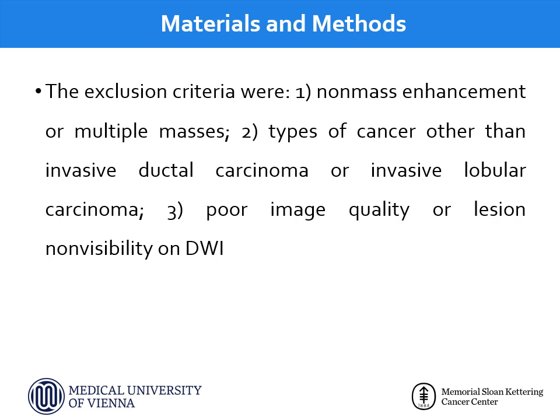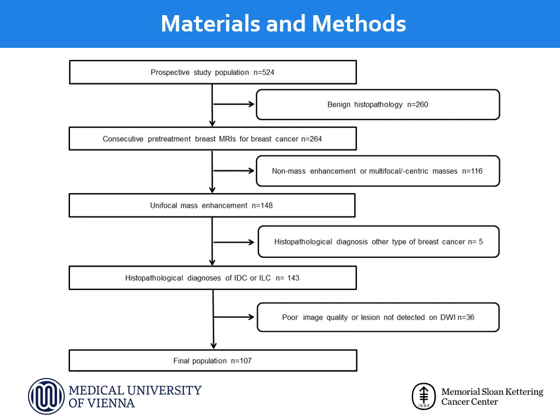The exclusion criteria were non-mass enhancement or multiple masses, types of cancer other than invasive ductal carcinoma or invasive lobular carcinoma, poor image quality or lesion non-visibility on diffusion-weighted imaging. Patient selection is here demonstrated. The final study population consisted of 107 patients.